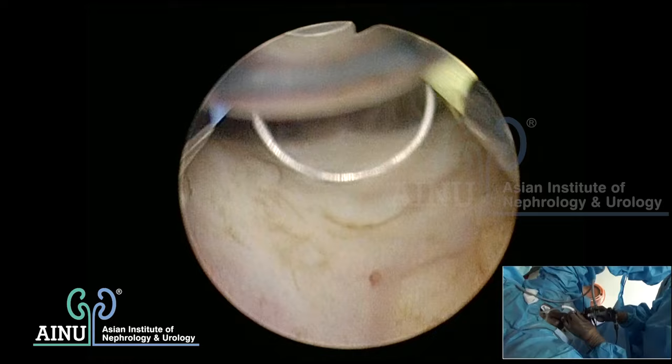I see multiple vessels coming through the prostate. Debulk everything and then start coagulation - there is no point independently coagulating at every point as you will waste time and energy. This is the debulking part happening now. Having done the debulking, you can see the whole part is debulked. Now I need to reach the capsule on the right side. At the same first cut location, I go and reach the capsule at every point.